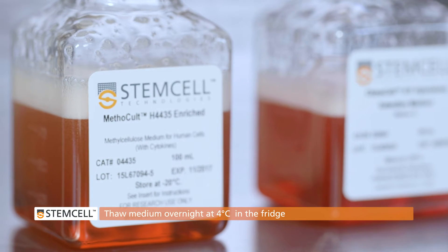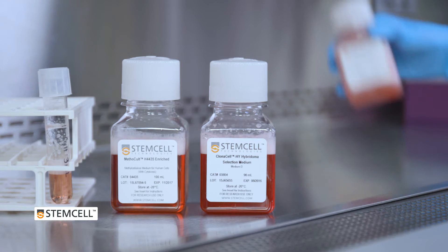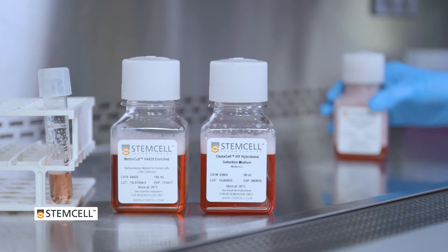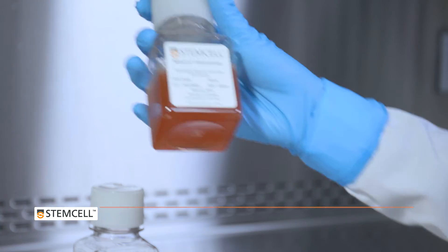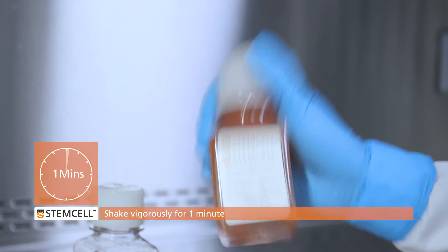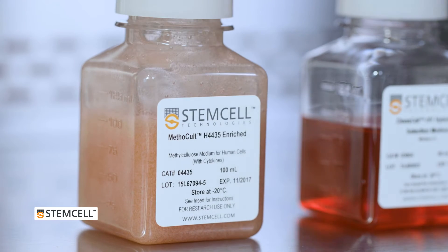Semi-solid methylcellulose mediums, such as Methacult or Clonacel, must be thoroughly mixed prior to use to ensure a homogeneous mixture and best results for your assay. To mix, shake the bottle vigorously for at least one minute. You should see the medium become opaque with bubbles.